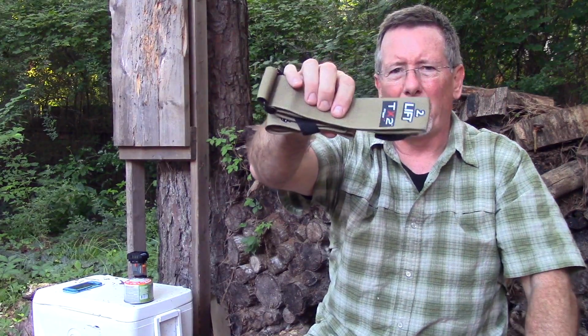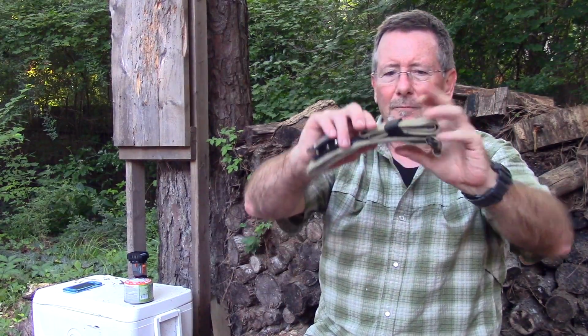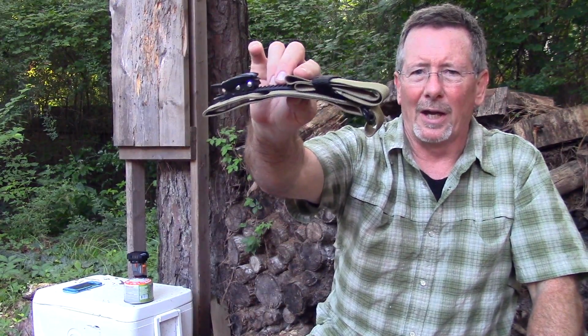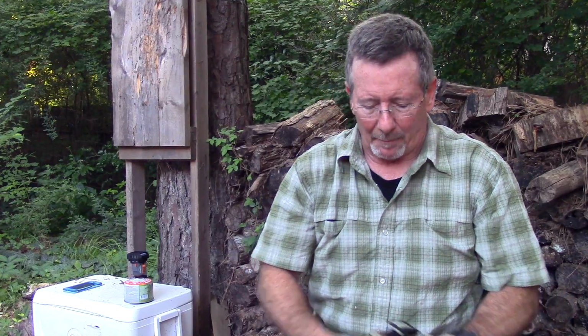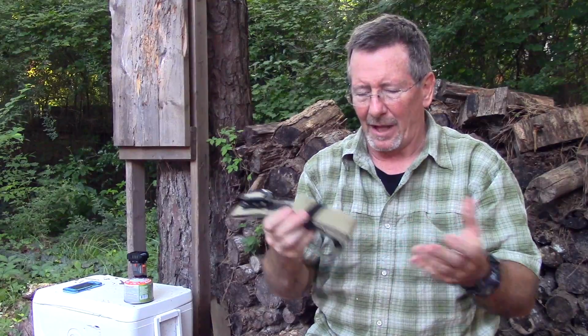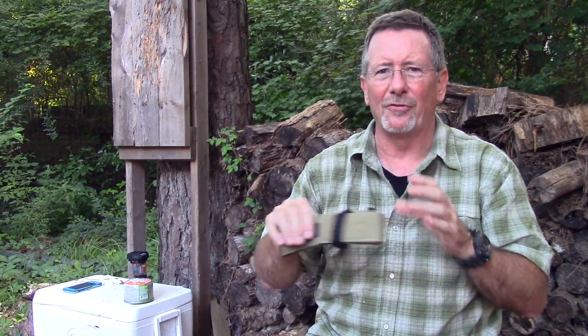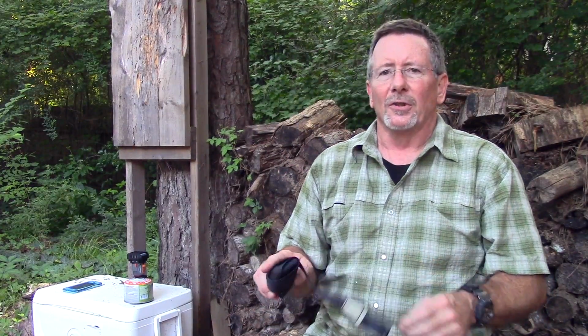You're not going to carry that in your pockets unless you have cargo pockets or something like that. You might put it in a bag, but I really think it's important to have a tourniquet on your body, because if you don't have your bag with you, or you drop your bag, you're not going to have a tourniquet. I guess you could put it around your waist, but I had to find another tourniquet. It's a great tourniquet, but it just didn't work very well for me for EDC. And it has the drawback of not being as easy to apply to yourself. So that's the ratchet one.